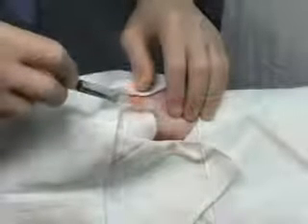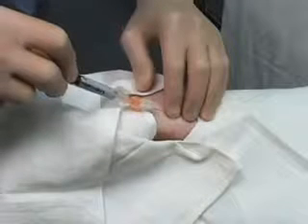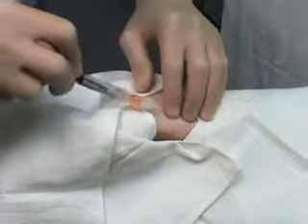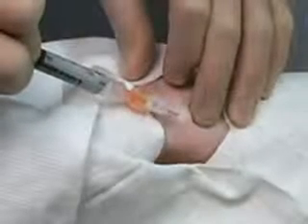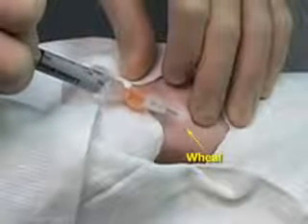Once positioned, the field can be sterilely prepared and draped using towels or a drape. As with all invasive procedures, meticulous care should be taken to minimize the risk of infection. After sterile preparation, a small wheal of 1% lidocaine can be infused in the conscious patient to help decrease pain associated with line placement. A small wheal should be raised.